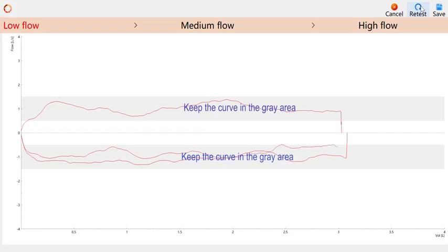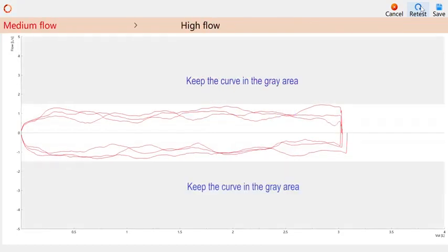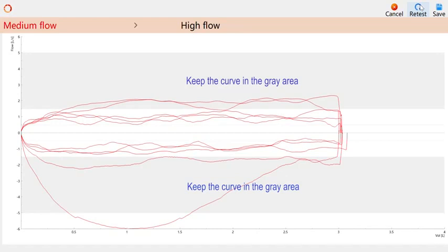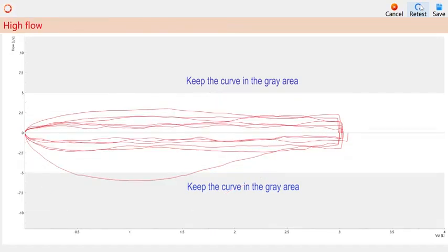Push and pull repeatedly for 3 times to enter the medium flow calibration. As for medium flow calibration, it should be in the gray area. The pull curve interval is 1.5 to 5, and the push curve interval is 1.5 to 5.